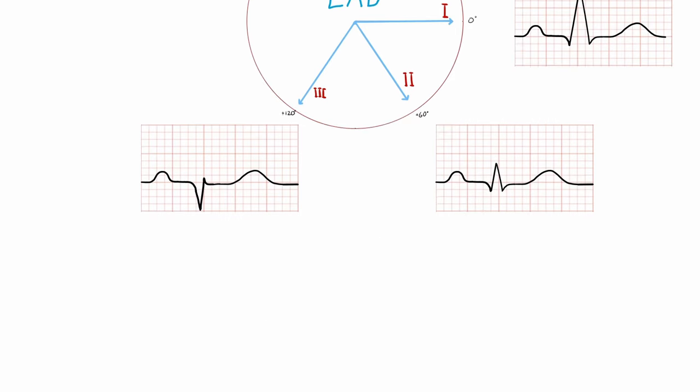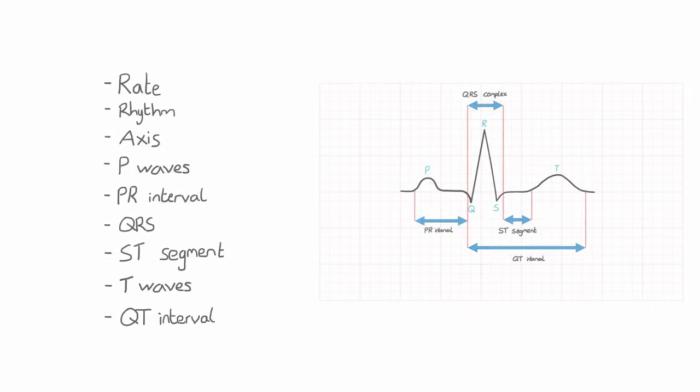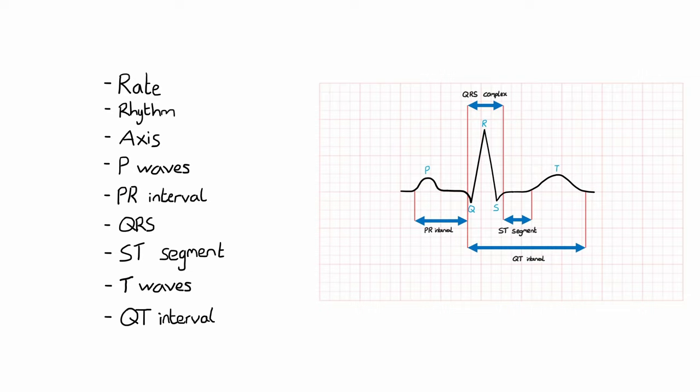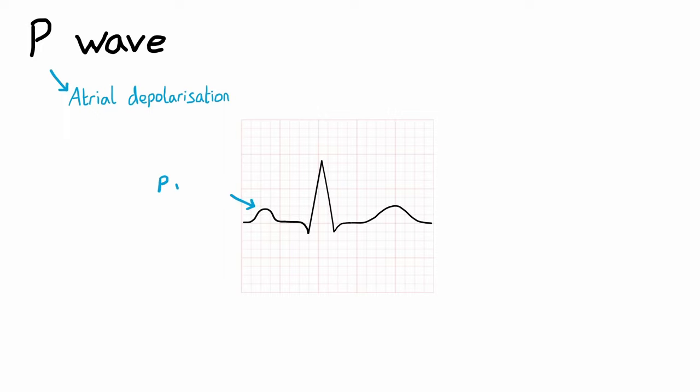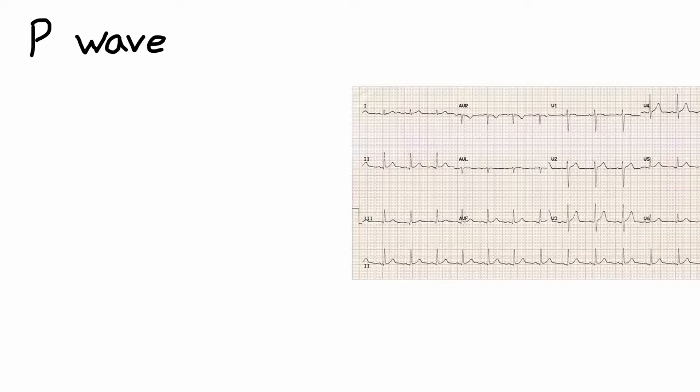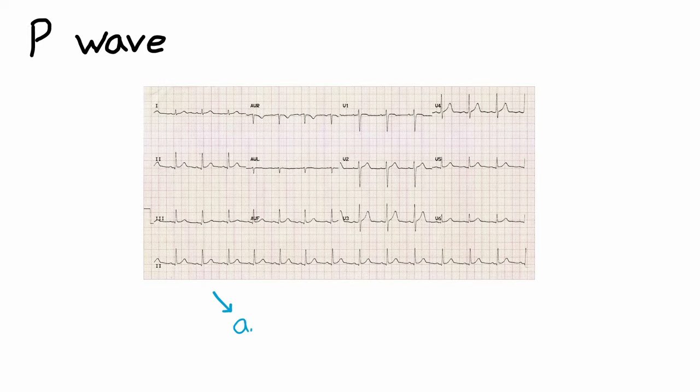From now on in the interpretation we're assessing individual components of the ECG complex, and it's therefore important to assess these components in all 12 leads of the ECG to avoid missing any abnormalities. First off is the P wave, which represents atrial depolarization. The questions we need to ask ourselves here are: Are P waves present and do they look normal? Remember we need to be checking this in all 12 leads.